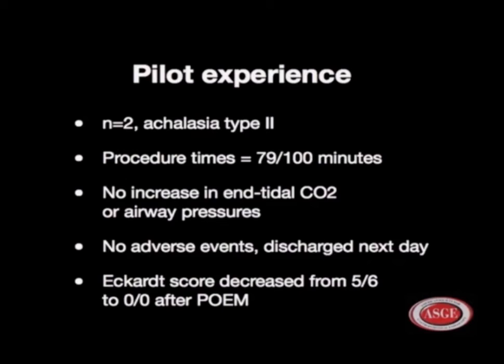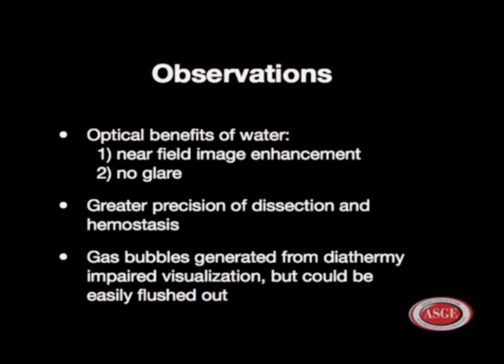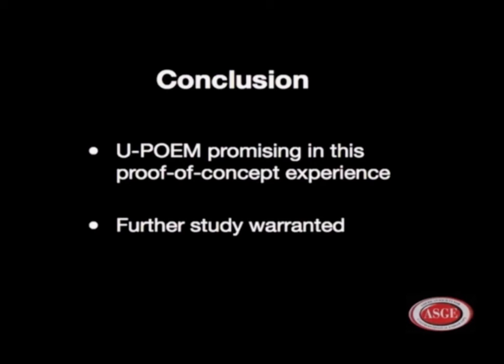Our observations: the optical benefits of water include near-field image enhancement and the absence of glare, contributing to greater precision of dissection and hemostasis. Gas bubbles generated from diathermy do impair visualization, but only momentarily and can be easily flushed out using the infusion. In conclusion, the underwater POEM technique is promising in this proof-of-concept experience, and clearly further study is needed.